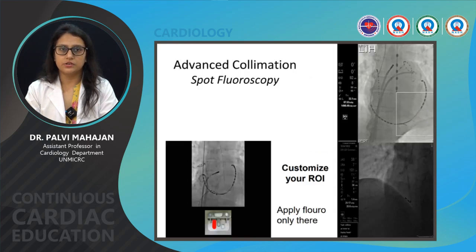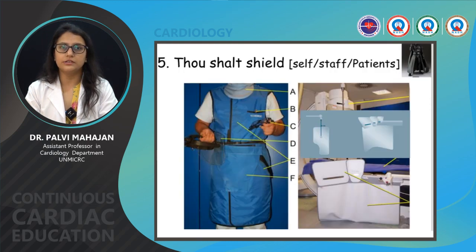Advanced collimation, that is spot fluoroscopy. This is a new technique in which we can customize our area of interest. So we can apply fluoro only where we have a specific interest. Thou shalt shield. Self, staff, patient.